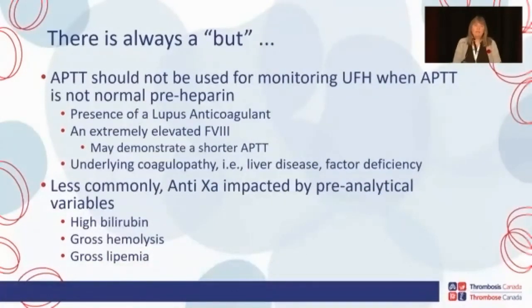Less commonly, even chromogenic anti-10A levels are going to be impacted, not very often, but they can be by some pre-analytical conditions such as HIL interference, hemolysis, icteric, or lipemia in the patient sample.